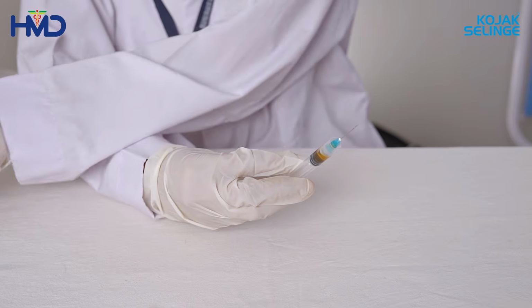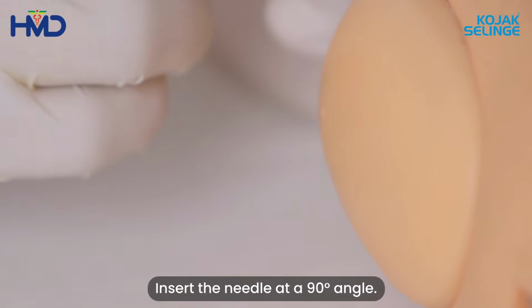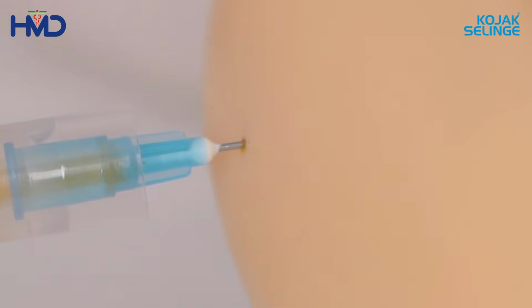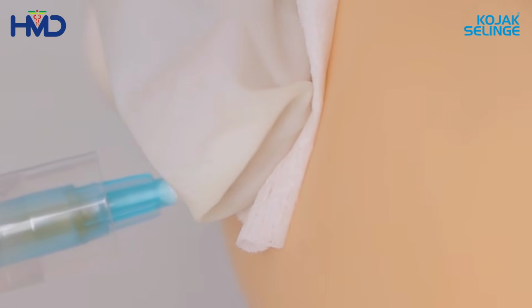Locate the injection site on the patient's body. Cleanse it with an alcohol swab and insert the needle at a 90-degree angle. Administer the vaccine by slowly pushing down the plunger. After administering the full dose, withdraw the needle and cover the injection site with a swab.